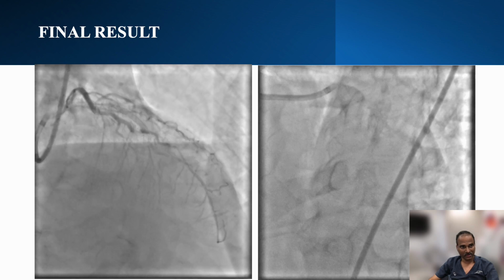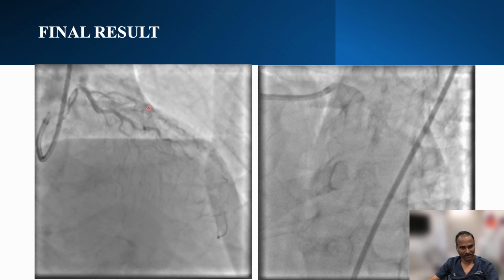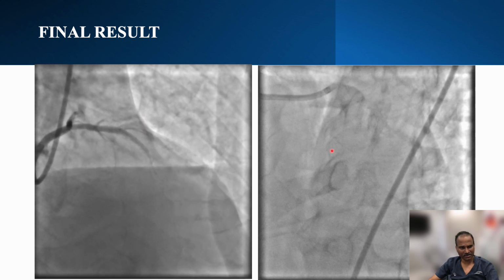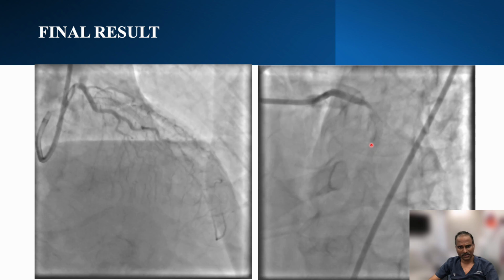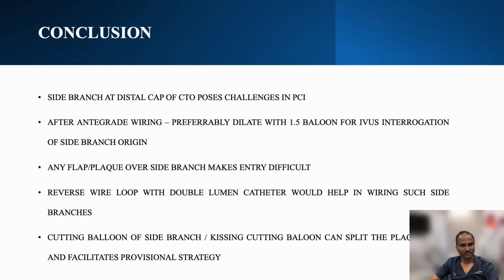And now you can see the diagonal is flowing nicely. And yeah, there was a small dissection here, but it's okay. That's not an issue, so that will heal. So this is the final result.